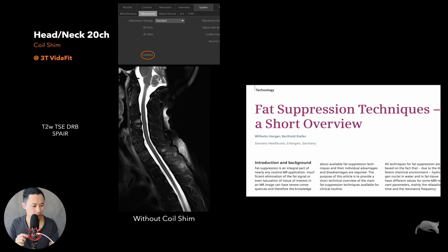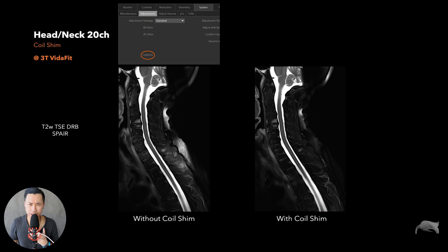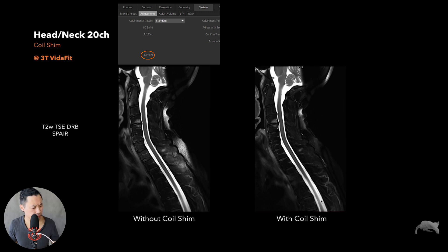Now the same image with the same parameters but with the coil shim on. My impression: it's working — it's working better compared to without. Some areas are still difficult, but for the spine itself it is working. You can see inhomogeneities in one image, but with the coil shim it's better.